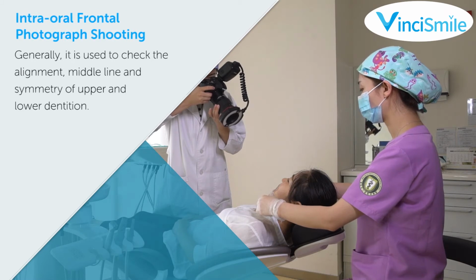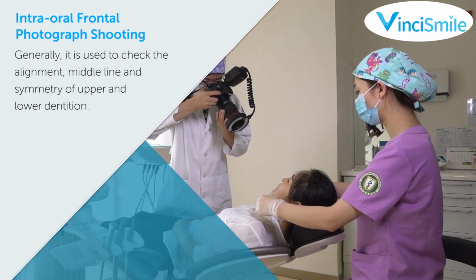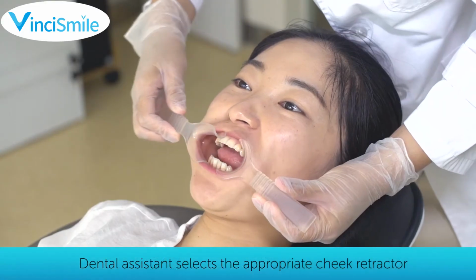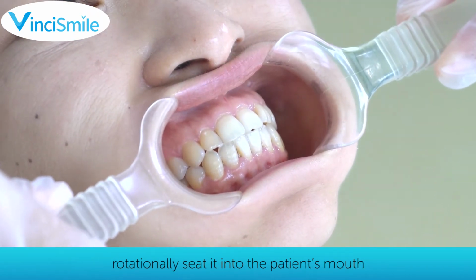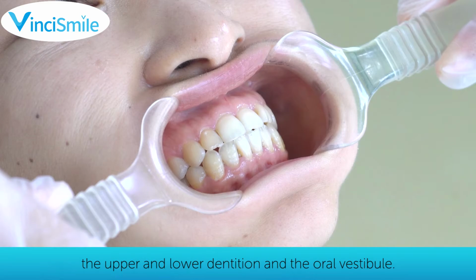Intraoral frontal photograph shooting. Generally, it is used to check the alignment, middle line, and symmetry of upper and lower dentition. Dental assistant selects the appropriate cheek retractor, rotationally seated into the patient's mouth, and pulls the retractor toward the respective ear to fully expose the upper and lower dentition and the oral vestibule.